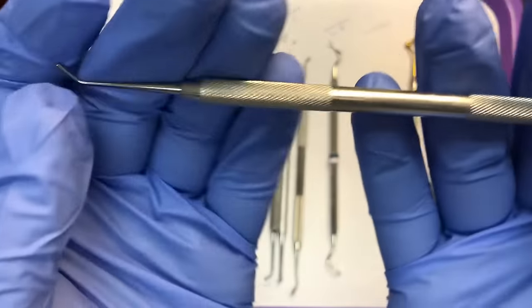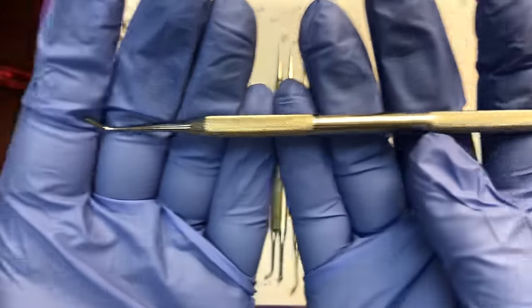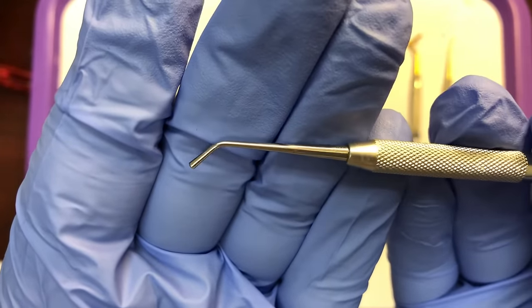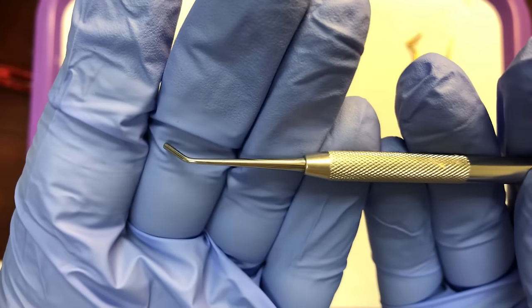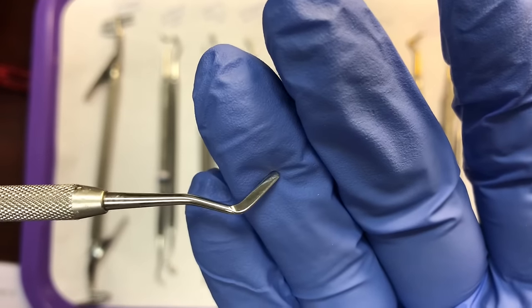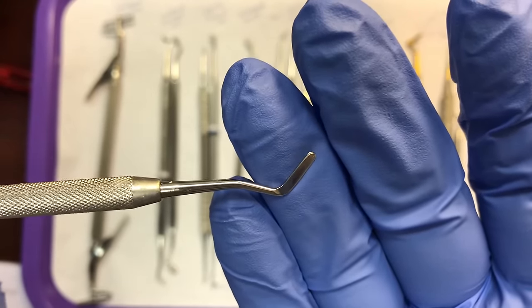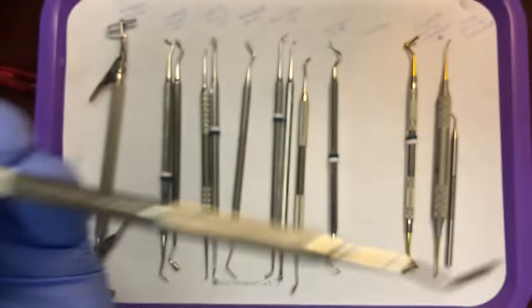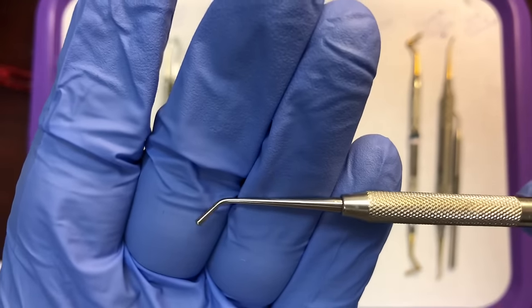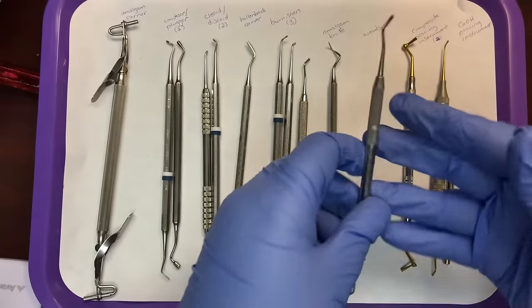Next in the restorative lineup is the Woodson. It's a double-ended instrument where one end has a condensing shape and the other end has a paddle shape. Based on its shape, the Woodson is great for placing restorative material into the tooth — specifically temporary material like IRM, Intermediate Restorative Material. Woodsons are used to place material into the preparation, and some doctors will even use it to place composite.